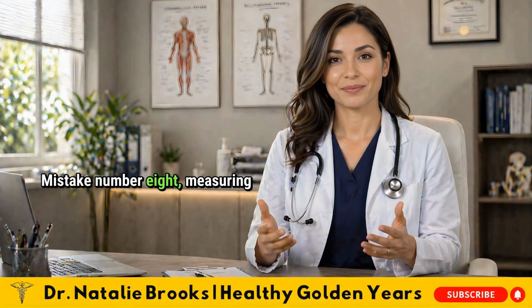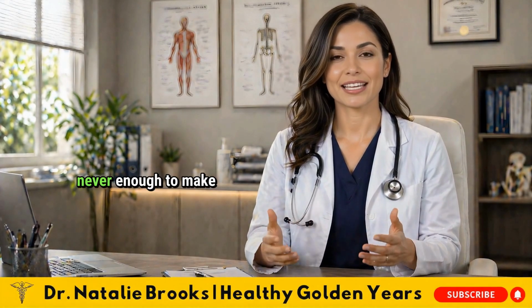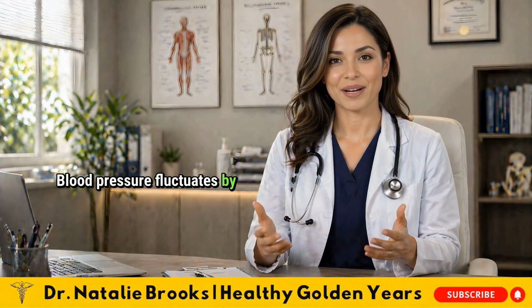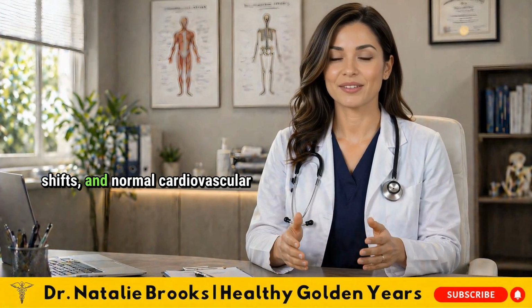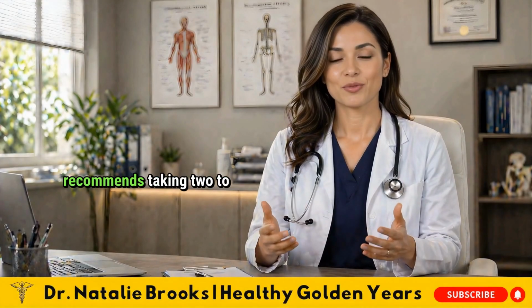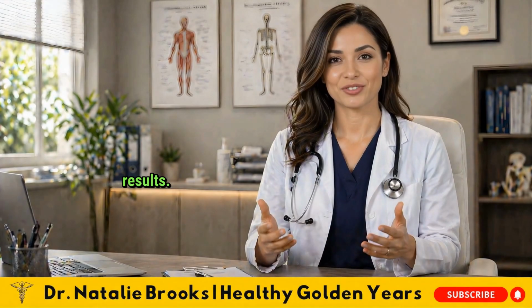Mistake number 8, measuring only once and trusting that single reading. One reading is never enough to make a clinical decision. Blood pressure fluctuates by the minute based on breathing patterns, minor emotional shifts, and normal cardiovascular variation. The American Heart Association recommends taking 2 to 3 readings at 1-minute intervals and averaging the results.